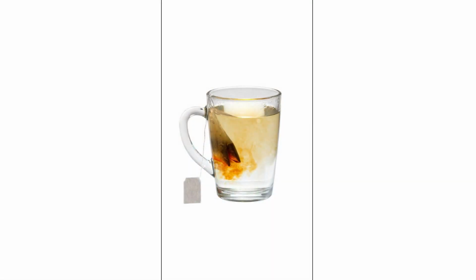Imagine you dip a tea bag into hot water. Inside the tea bag, the essence is highly concentrated. Outside, the water is almost empty. So slowly, tea begins to spread from the high concentration inside the bag to the low concentration outside.